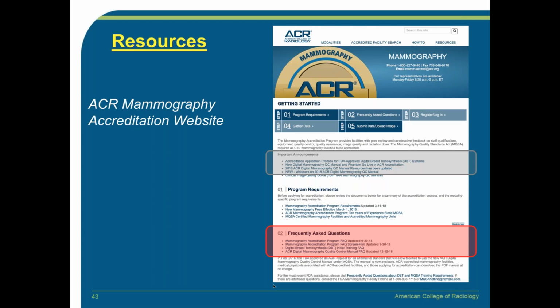The second question is, are inspectors ready for this manual? MQSA inspectors were advised when the DM QC manual was approved in 2016 for just FFDM that facilities had the choice to use this manual at that time, and MQSA inspectors have been advised by headquarters that facilities have the ability to choose to use this manual at this time.